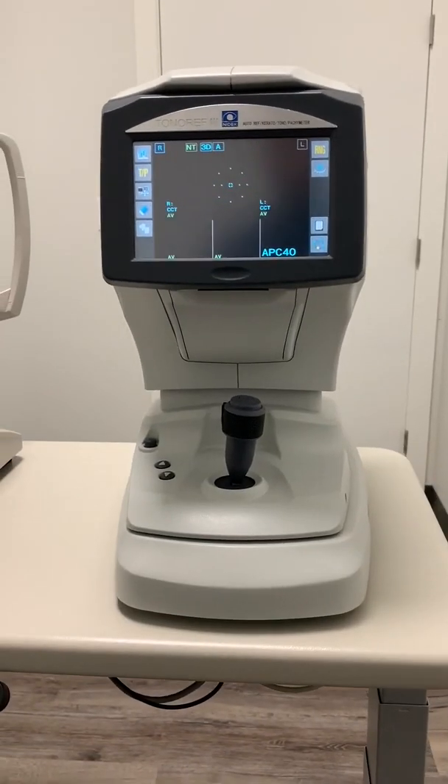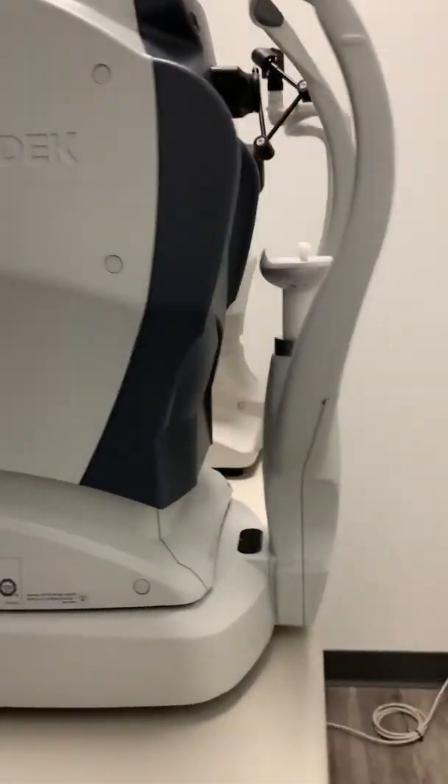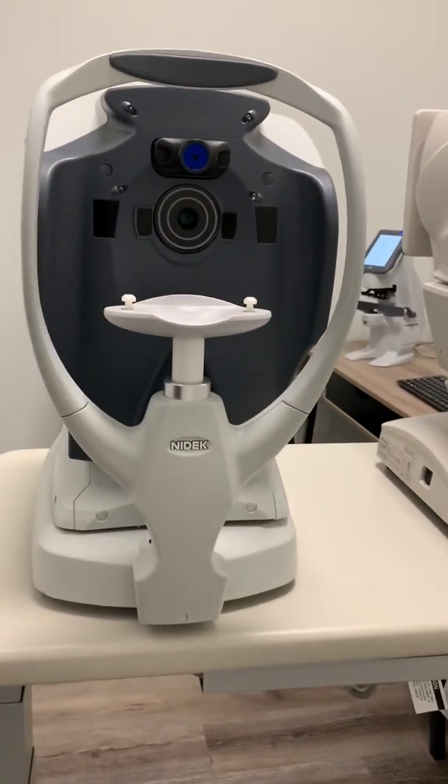The next piece is the autorefractor. In our clinic's case, our autorefractor and our non-contact tonometer are two in one machine. What the autorefraction does is it gives us an estimate of what a patient's refractive error is, so it almost acts as our starting point when we do the one-or-two test that everybody loves.